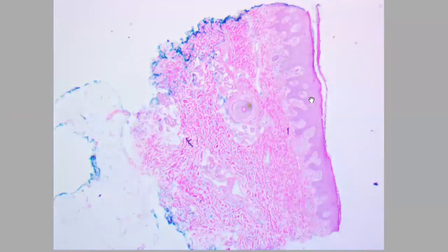And this will result in epidermal thickening, which we call acanthosis, and elongation of the rete ridges, as you can see here. And sometimes they describe these elongated rete ridges, this one and this one, like test tubes standing in a rack. Can you see this one? All these are like test tubes sitting in a rack.